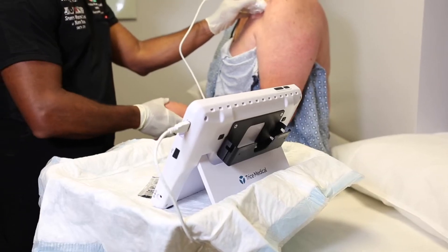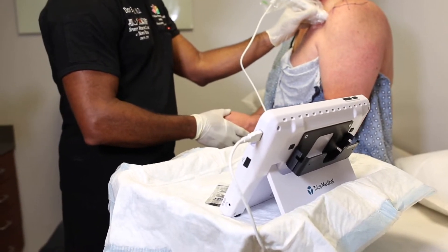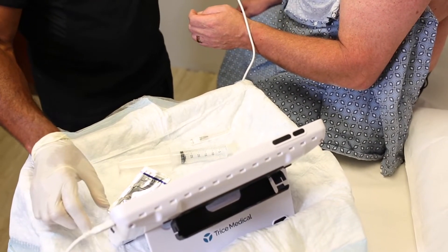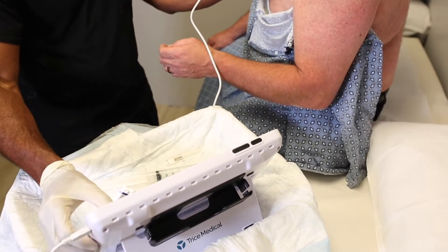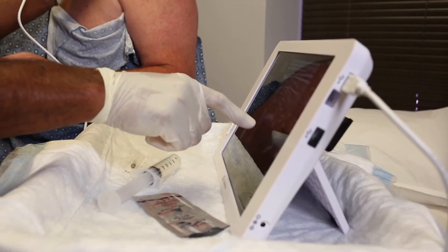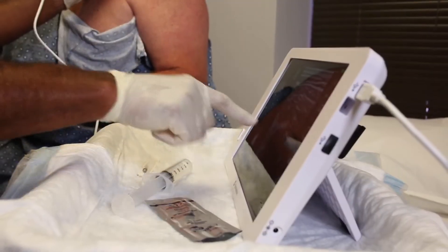Just medial to the coracoid lies the suprascapular nerve, which is our target for this ultrasound-guided block. This procedure can be done in the seated position, but most commonly I lay patients in the supine position because they're more comfortable and it's easier to perform the procedure in an ergonomic fashion for the clinician as well.